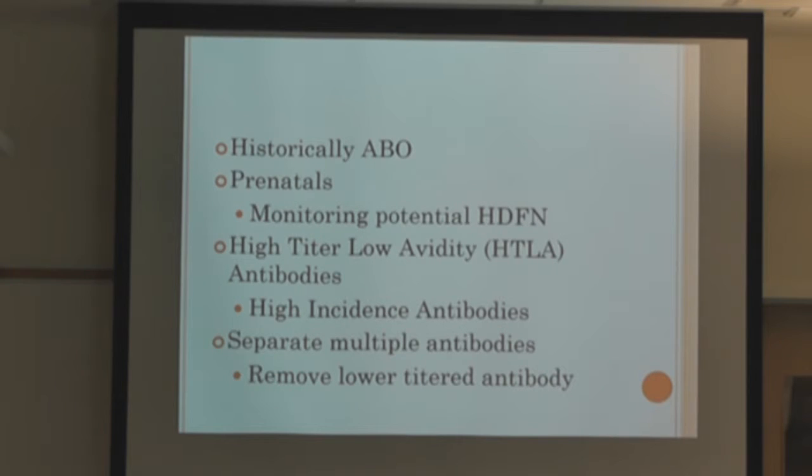So there's a little bit of, I guess, science involved in the whole process. Even though it's a very simple test, it's very, I guess, basic to science in general, not anything special for the blood bank. This is just standard serial dilutions.